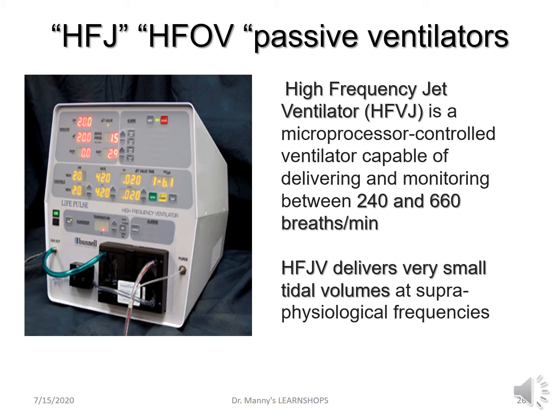Typically they're not breaths per se as we understand a breath to be, but they deliver very small volumes of gas at supraphysiological frequencies. And these are typically used for patients that have got very severe lung disease, where ventilating them normally may promote even further ventilator-induced lung injuries or ventilator-associated lung injuries.